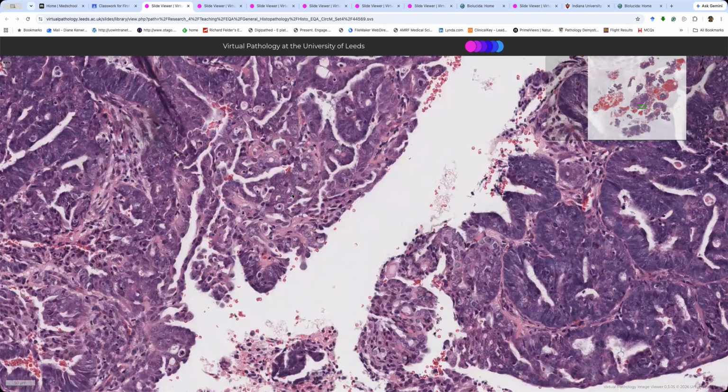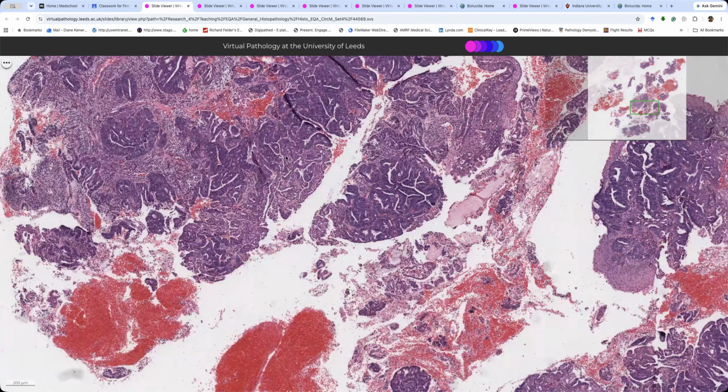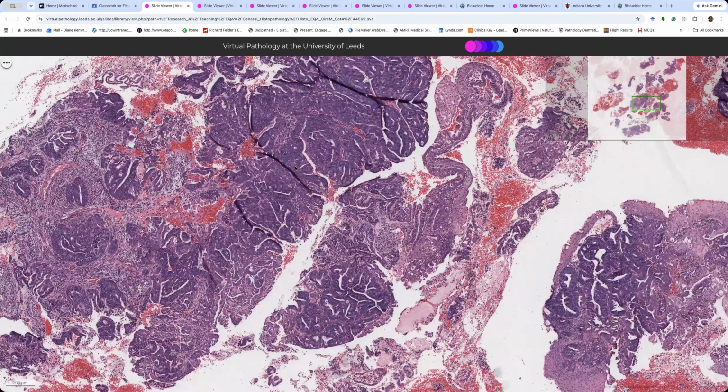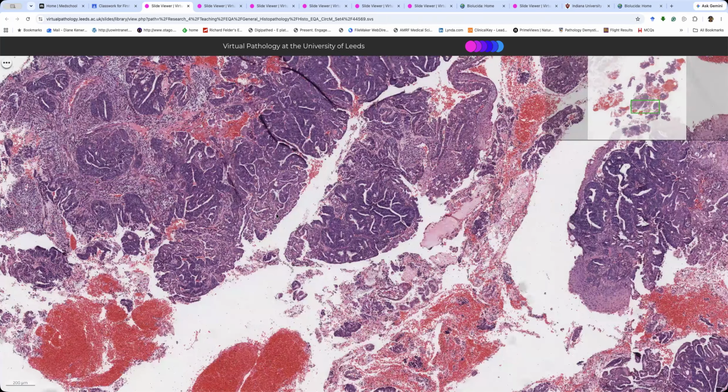Okay, tell me what percentage of endometrioid are mixed with serous? All right, we've got 1%, 10%, or 20%. You're very generous. So Tom's put 1%, and the answer is 1% or less. So it's not usually mixed. It's usually one thing or the other.